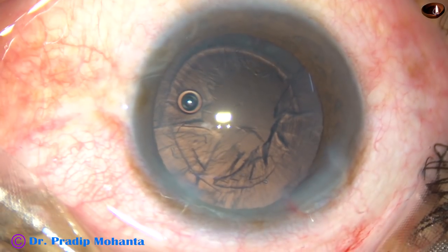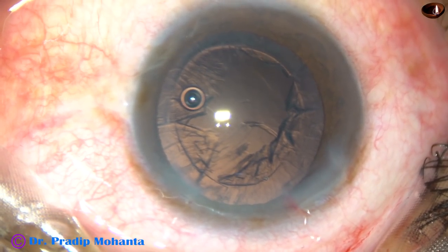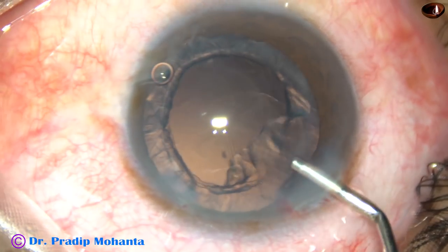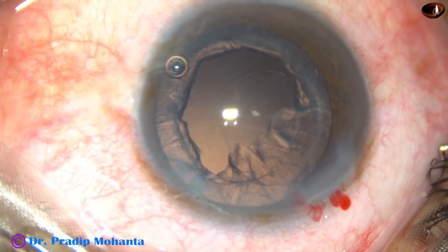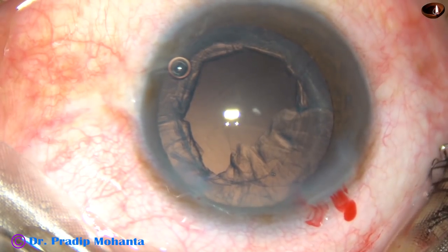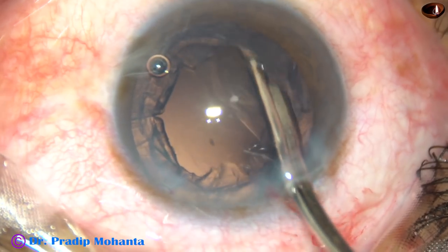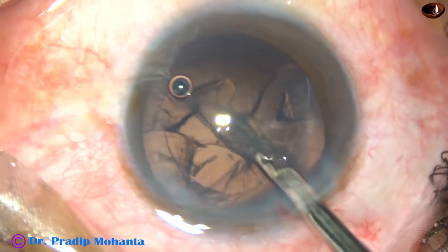This is a very fast and very safe technique. One equator supports the posterior capsule and you are working on the other equator, which is in the supracapsular area. Never come too anteriorly — keep the tip of the FACO handpiece at the anterior capsular plane.